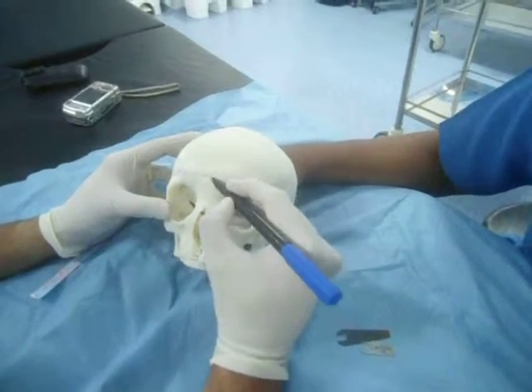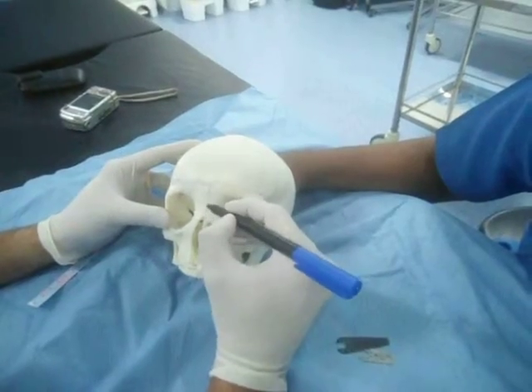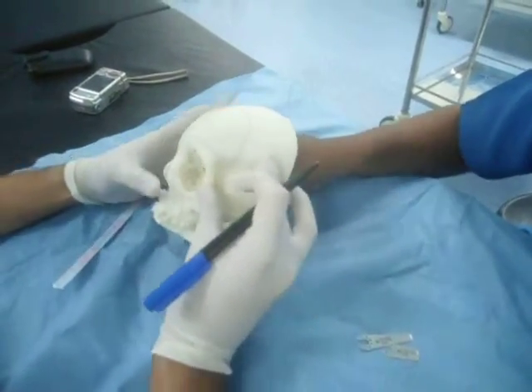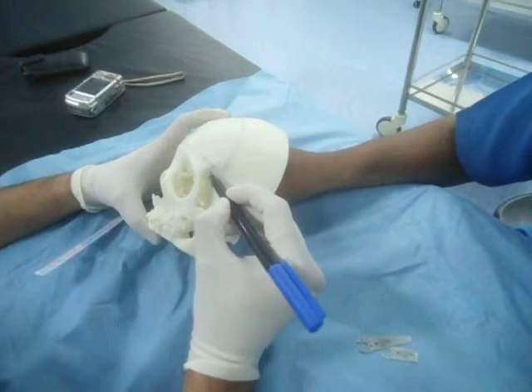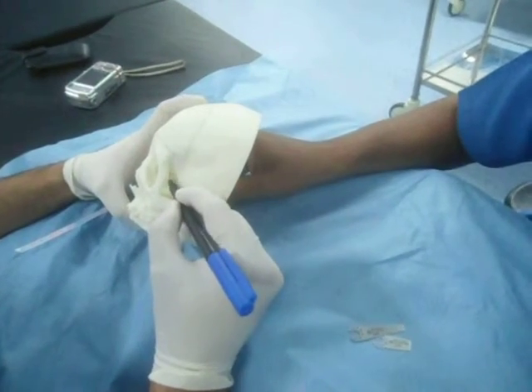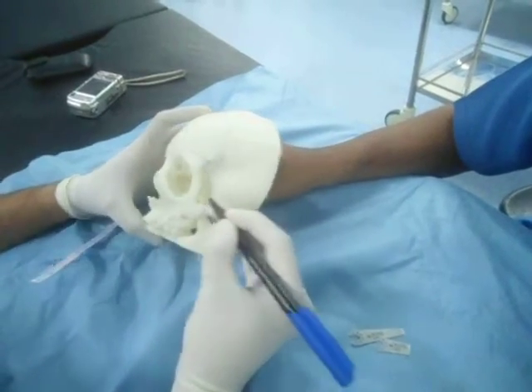Our next step is to mark the midline. Now let's move on to the orbital osteotomies. So along with the supraorbital osteotomies, we will mark out the lateral osteotomies, zygoma.